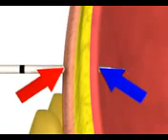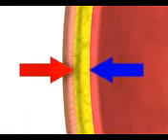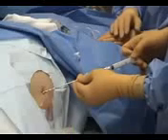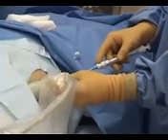When the catheter is withdrawn at the end of the procedure, the cutaneous entry site will retract to its original position. Both techniques ensure that the cutaneous and peritoneal insertion sites do not directly overlie each other, theoretically minimizing the risk of an ascitic fluid leak following the procedure. Intermittently pull back on the plunger as you continue to advance the needle through the subcutaneous tissue. Bedside ultrasound may be used to confirm proper placement.